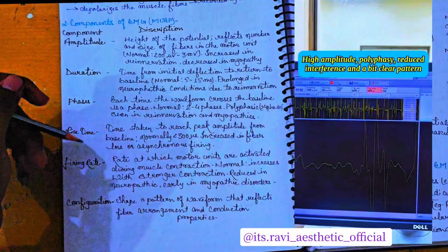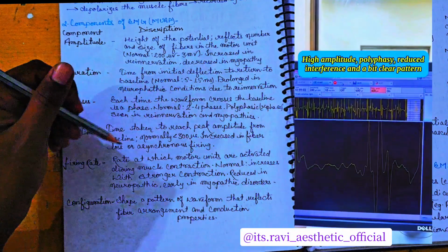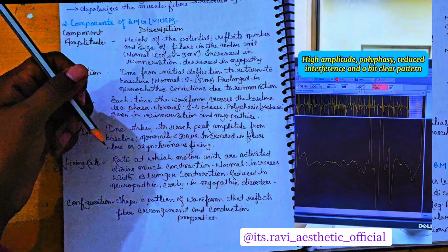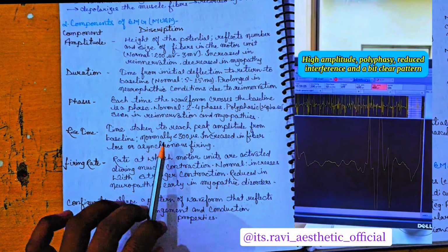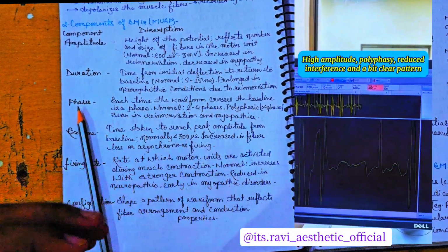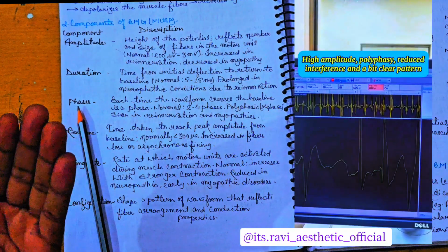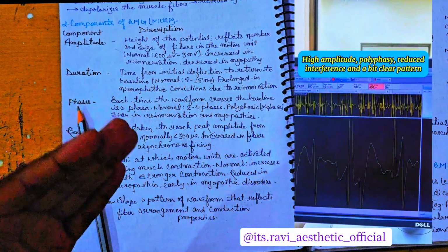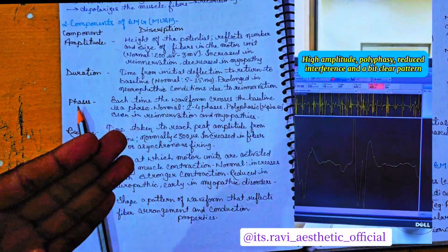So what is the rise time? It is the time taken to reach peak amplitude from the baseline. Normally it is less than 300 microseconds. It is increased with fiber loss and asynchronous firing. It relates to the firing of the muscle contraction shown on the electromyography, and 300 microseconds is the ideal value.